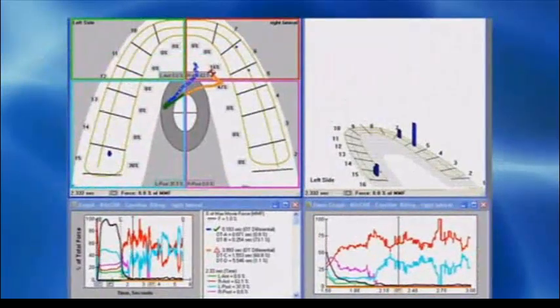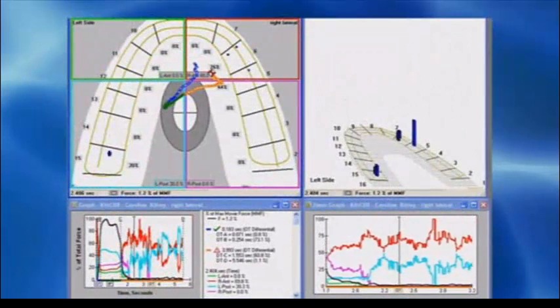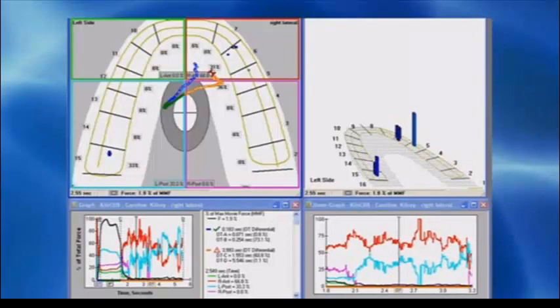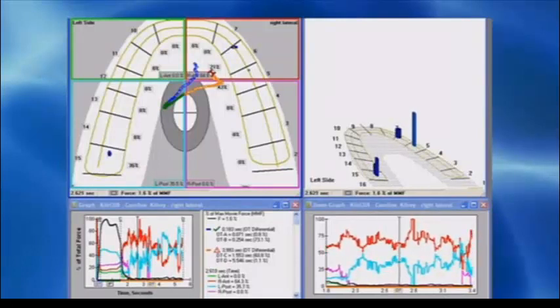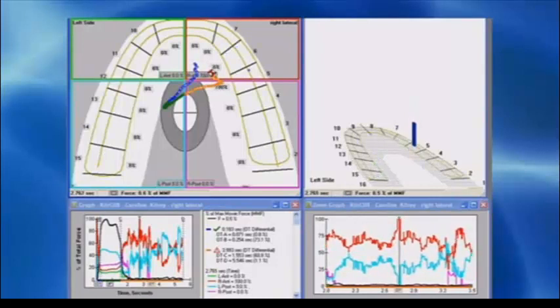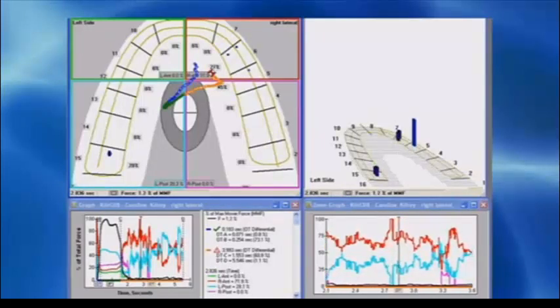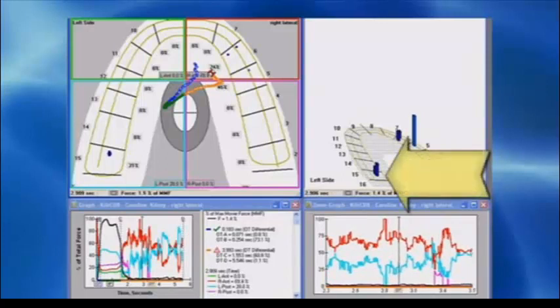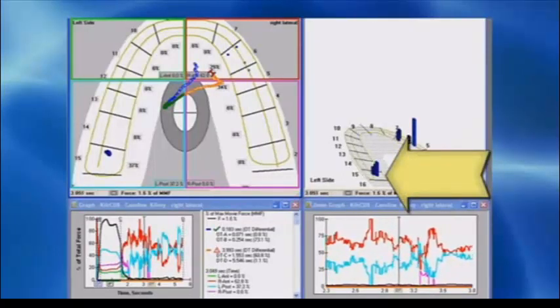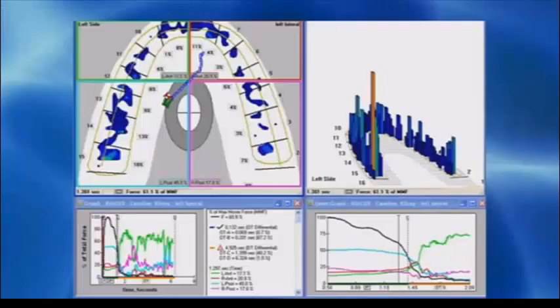And that's the kind of thing that we can measure with the T-scan technology that's impossible to see by visual inspection. And so here, a goal would be to have your back teeth separated in less than half a second, and you're dragging your back teeth together for a very long period of time. Actually, when you move to the right, your back left gets in the way and stays in the way during the entire movement. So let's take a look at going to the left.